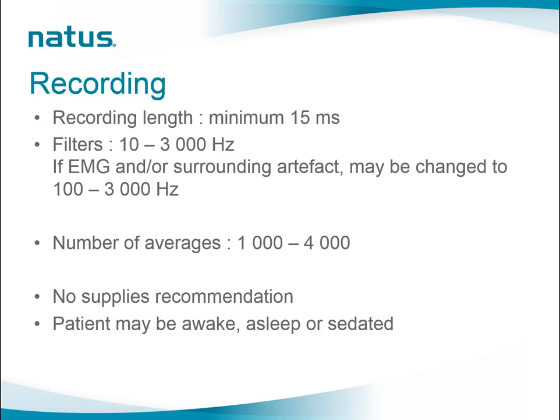The ACNS does not provide any recommendation in terms of supply use. And in terms of patient condition, this test can be applied whether the patient is awake, asleep, or sedated. So if there is a very difficult patient or children, sedation may be used.